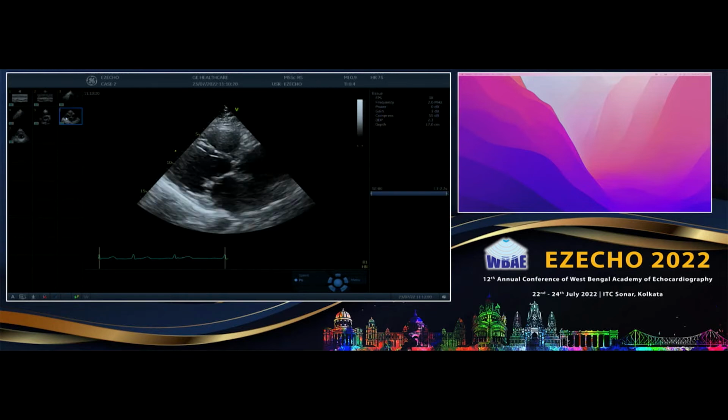So I think we are looking at mitral valve disease and also aortic valve thickening. Interestingly, I am seeing that once we switch off the harmonics, the frame rate goes very low.